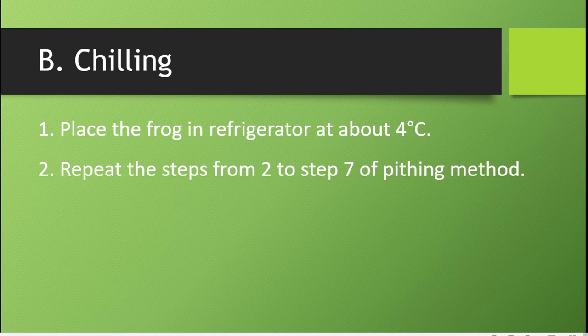Next is the chilling method. We have to place the frog in a refrigerator at about 4 degrees centigrade, and we have to repeat the method which we have already learned in pithing.